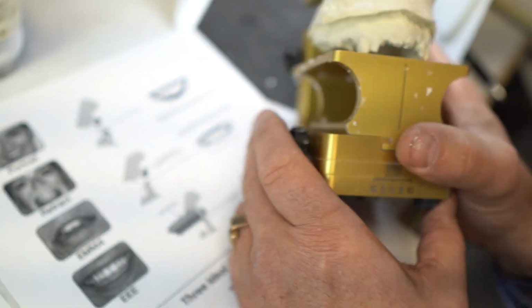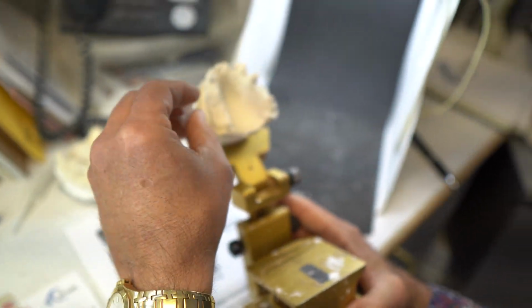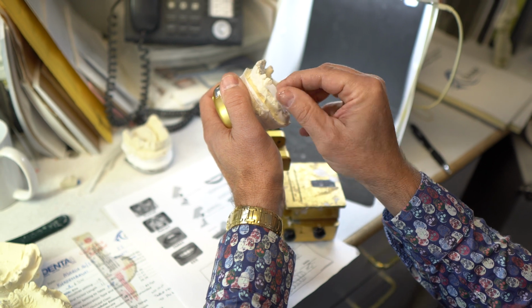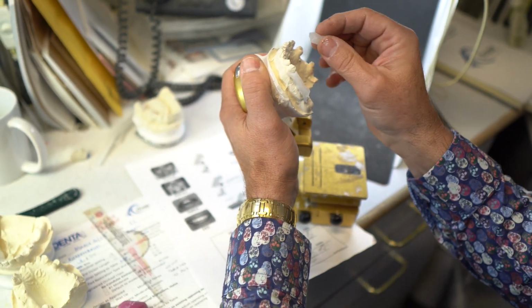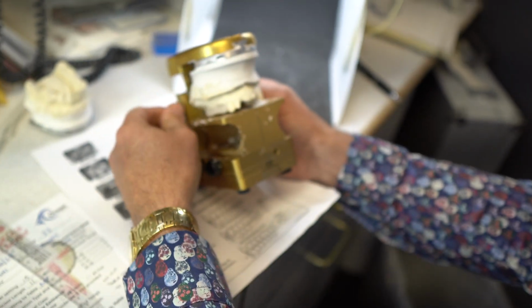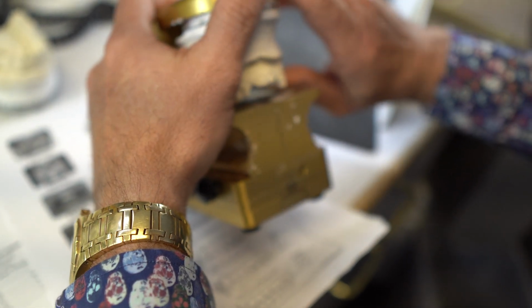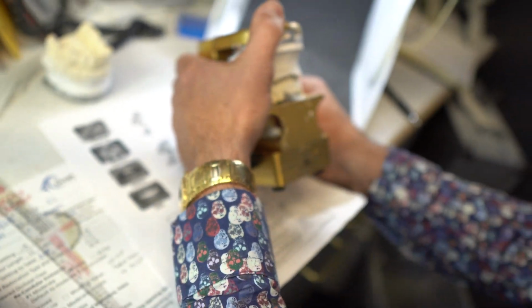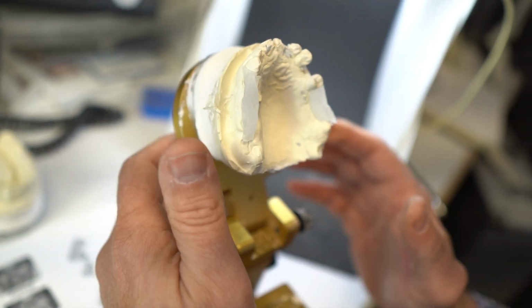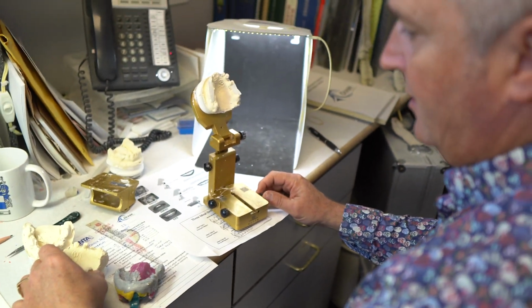Okay, so now that we've determined that, I made these little quick jigs just as an estimation to see where we are at. And you'll see, I'll just put these in here quickly and get that set in here. So that one, and then this guy. So this is just an eyeball guesstimation of where the new occlusal plane will be. Okay, this is not an exact science, but as technicians, when we're engineering stuff and trying to figure out where the goalposts are, we now know that this is relatively a close occlusal plane. And now we're going to see how it matches up with the bite.